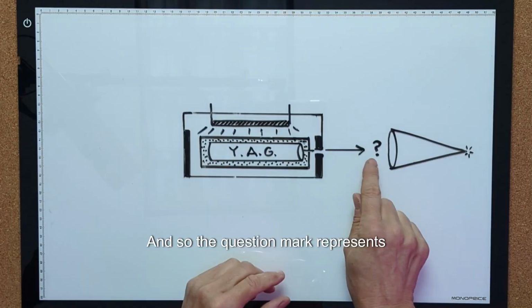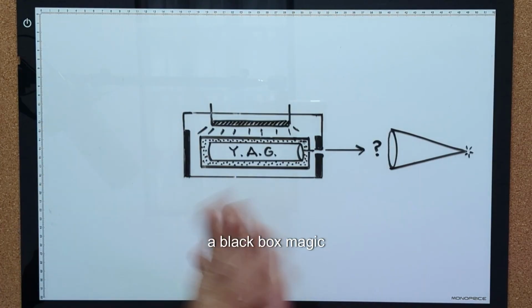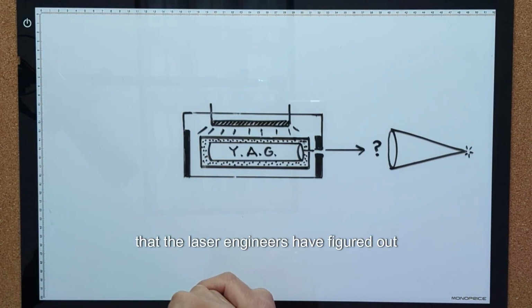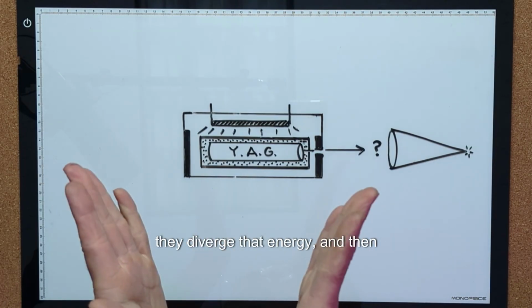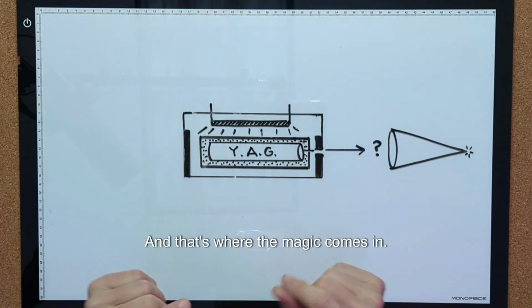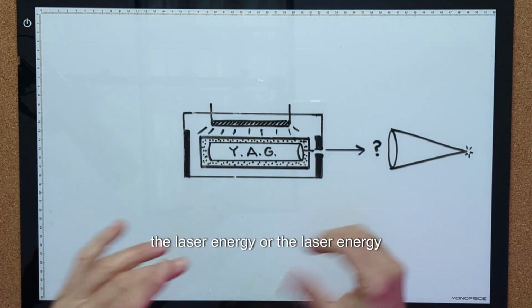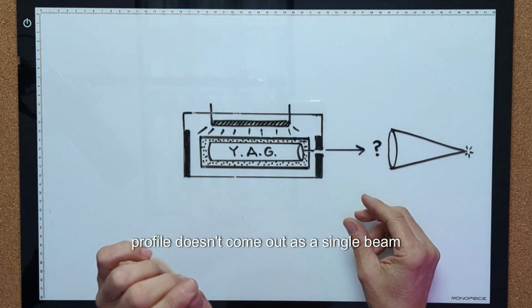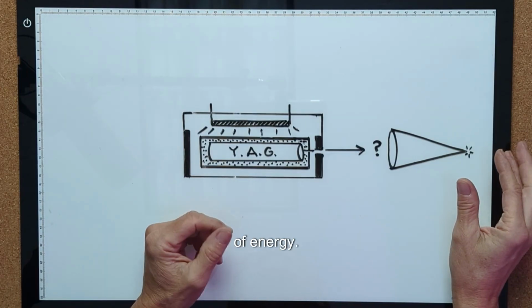And so the question mark represents some kind of black box magic that the laser engineers have figured out to take that single beam of light, diverge that energy and then reconverge it, and that's where the magic comes in. So the laser energy profile doesn't come out as a single beam of light. It comes out as a cone of energy.